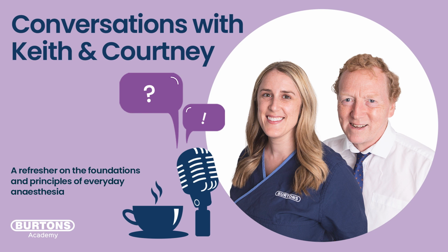And that's not pressure cycling, that's pressure limiting. We're basically saying to the machine, if it gets to this point, just stop. Don't continue to put any more gas in, go back, allow expiration to occur, and then begin inspiration again. So we've got that pressure upper limit of, say, 15, which is 5 to 6 centimeters above what we're expecting to see.